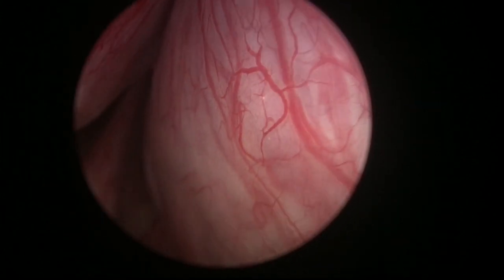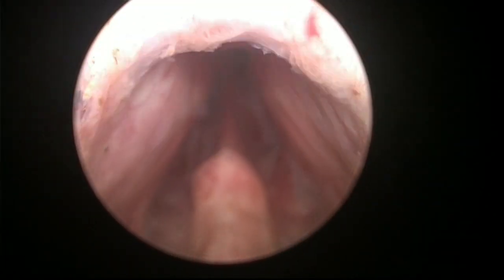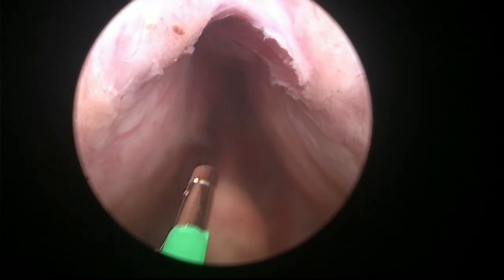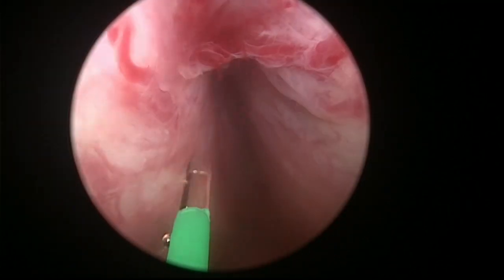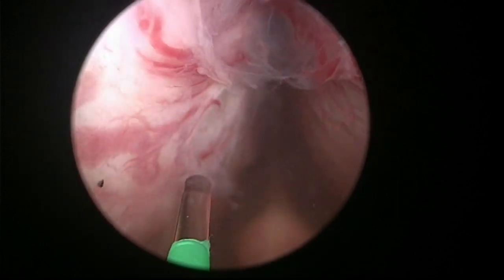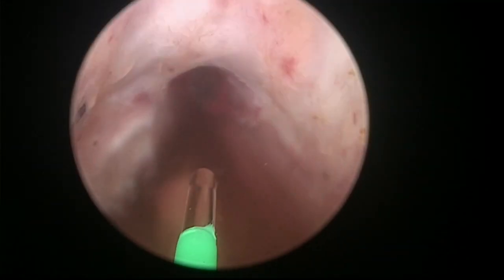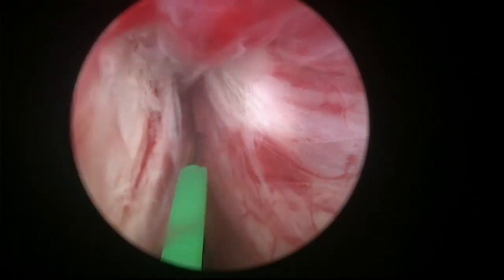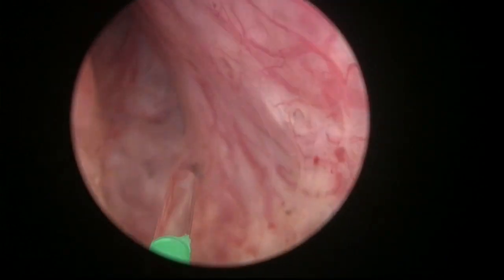The size estimation of this prostate is 160 cc. You see, it already started splitting, so I didn't want to force any more because we can, let's say, compromise sphincter function from the very beginning of the operation. I'm going to mark the landmark here. See, the sphincter is here. It's closing very nicely. I'm happy with this landmark, let's say, delimitation.